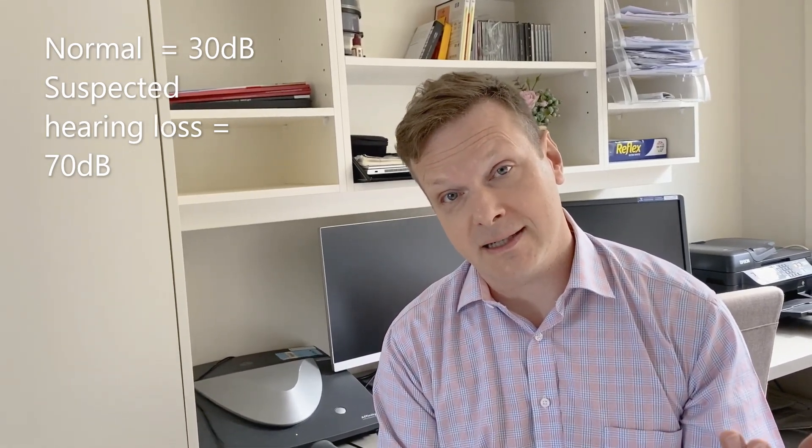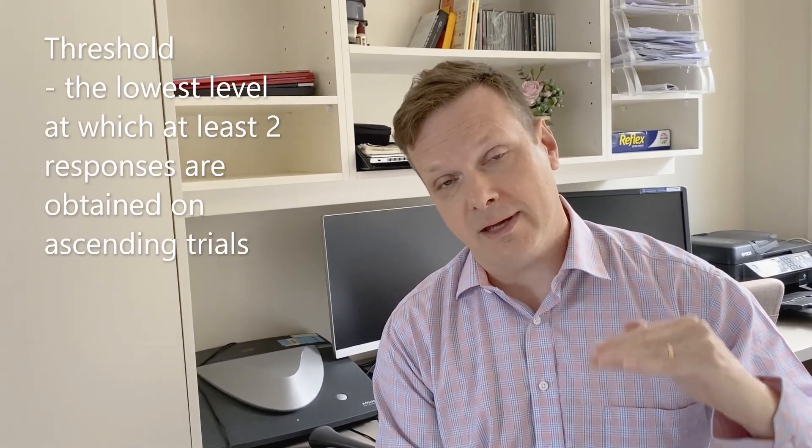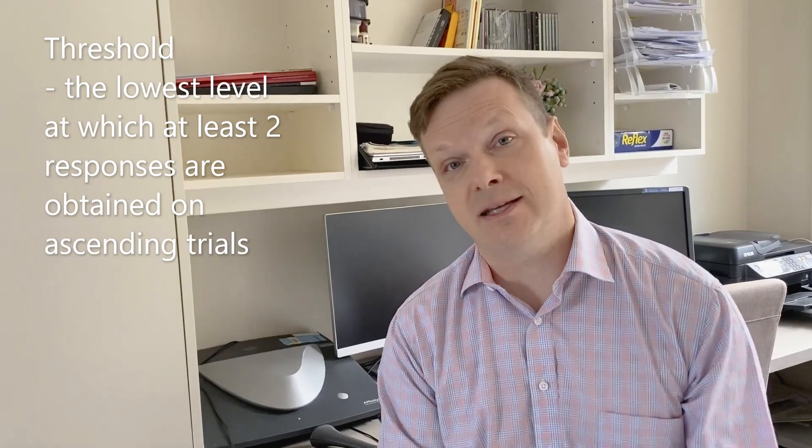If they've got a suspected hearing loss you might start at say 70 decibels. The technique involves starting — say the person's threshold is actually at 5 — you might start at 30 and then go down by 10: 30, 20, 10, then 0. They've heard all of those, so you go up by 5. You go up from 0 to 5, they'll probably hear that. Then go down by 10 and keep going up again. When they've responded twice at the softest level on the ascent, that's the person's threshold.